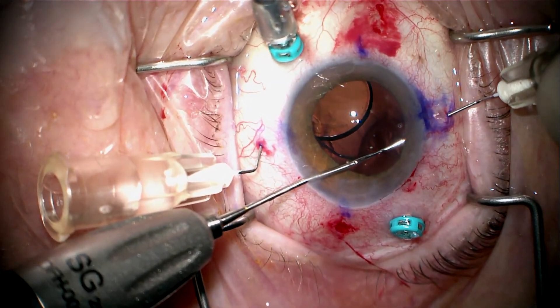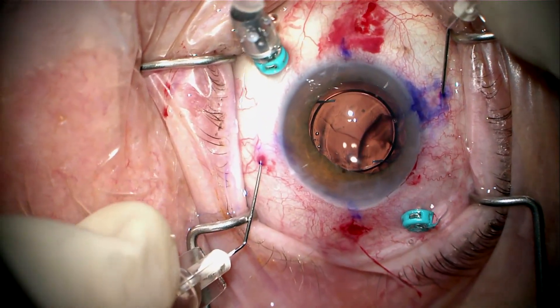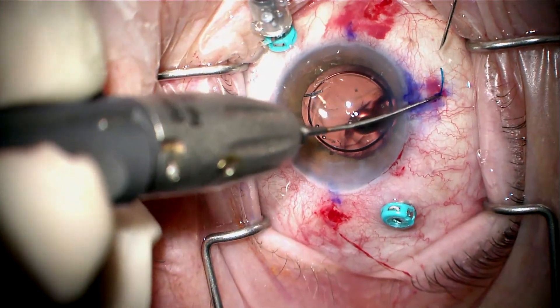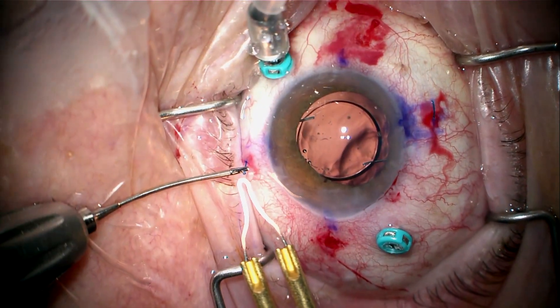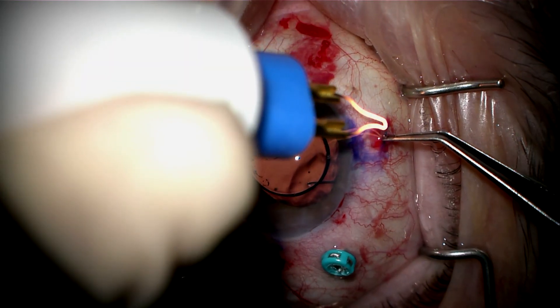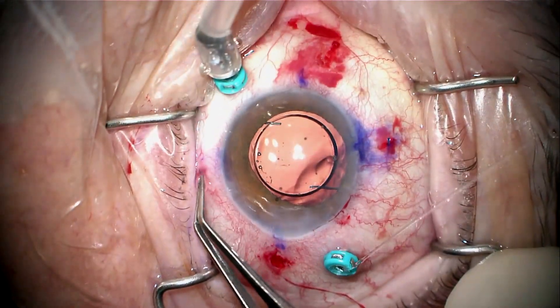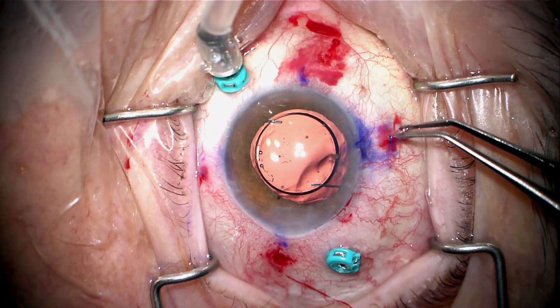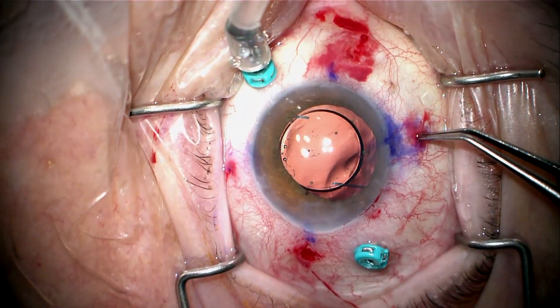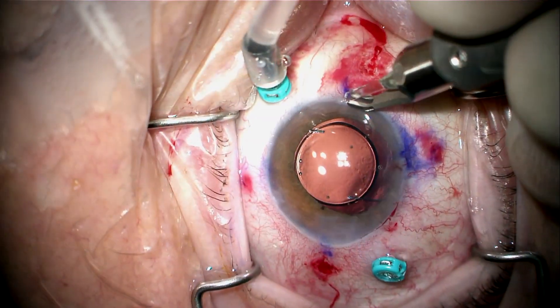You don't have to push it too far — just two millimeters or so. I now pull both needles out of the eye, rotating the lens and taking the haptics out with the needles. Now the lens is centered nicely. I melt the flanges, holding about one to two millimeters from the tip and melting into the forceps to get a mushroom-shaped flange. I push the flanges into the scleral tunnels and make sure the conjunctiva and Tenon's is freed up and mobile over the flange so it doesn't snag and pull the flange out.